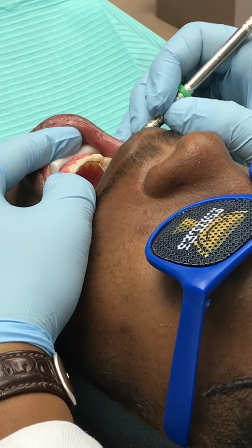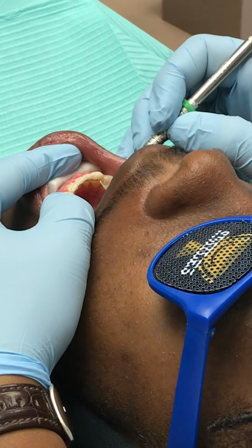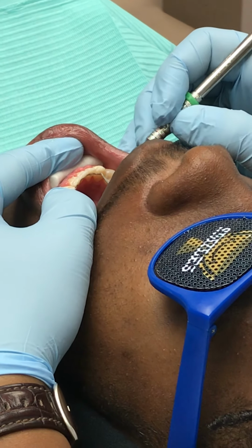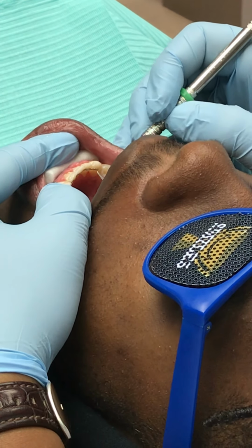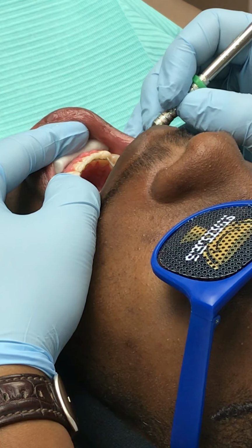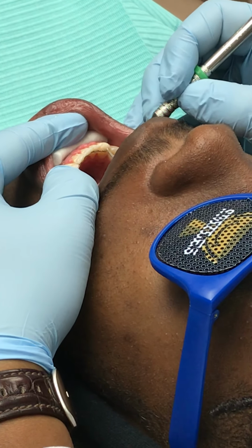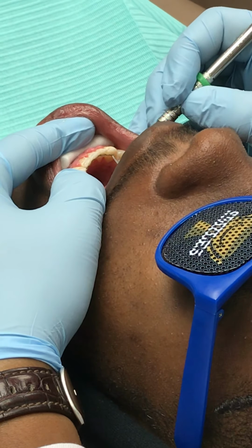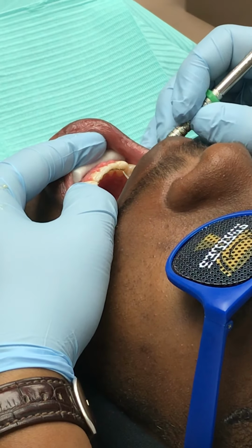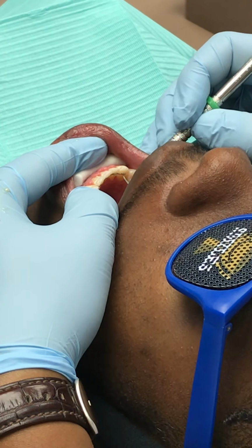I look at the lower right canine, I can get a little catch with my scaler. I don't want that catch there. I want a nice smooth transition of adhesive. The catch is on the gingival aspect. When I go from the incisal aspect, it's a nice smooth contour from the enamel to the adhesive to over the wire. But when I go on the gingival, there's a catch. That would be a plaque trap, so we're gonna add adhesive right there to make sure it's smooth.